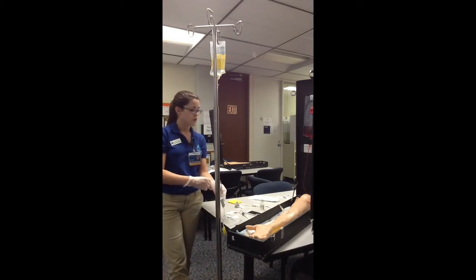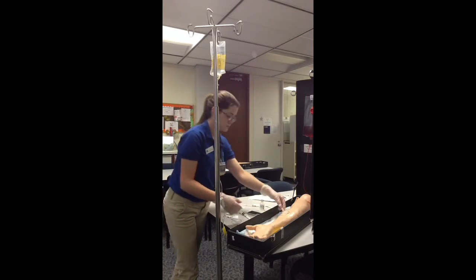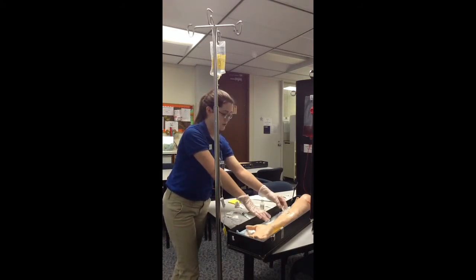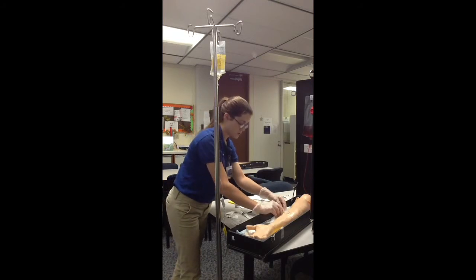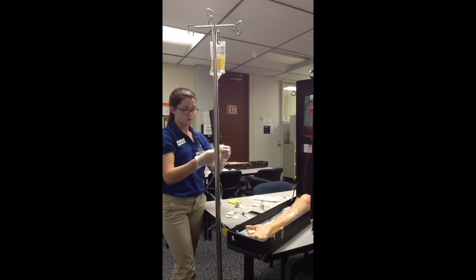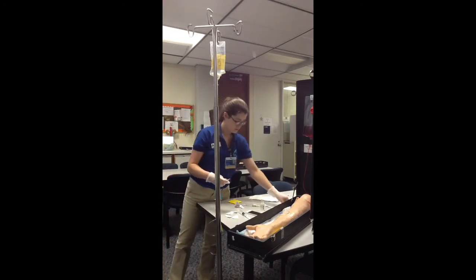Fine. Okay, so now her medication is over, it's finished, so I'm going to come back, and again I'm just going to check the IV site for any phlebitis or infiltration, and that looks good. So I'm going to clamp the INT while removing the needleless device. And this is an old one, so I'm going to throw this one away.